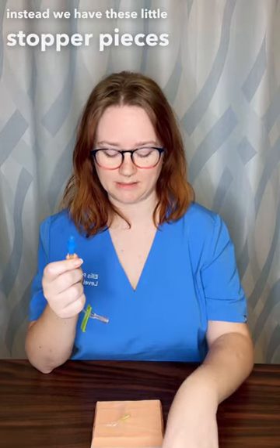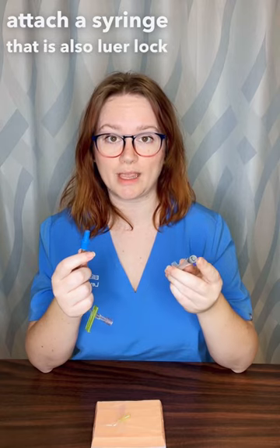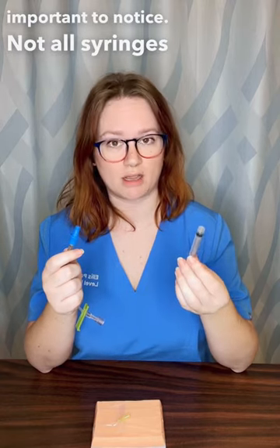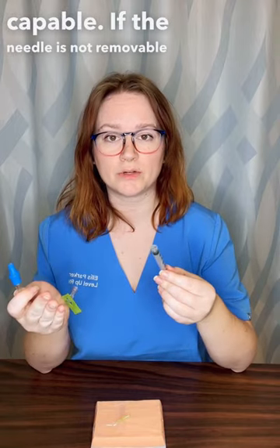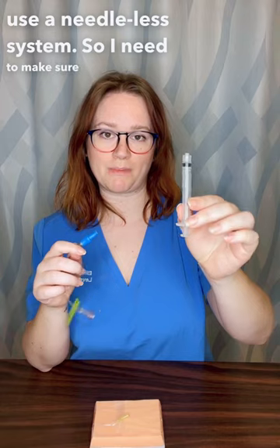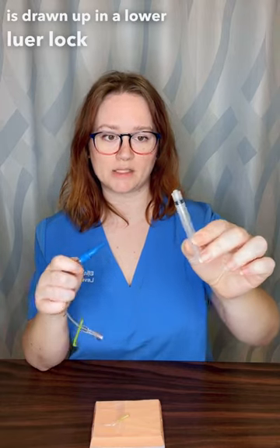Instead, we have these little stopper pieces that we can attach a syringe to that is also Luer-lock capable. Not all syringes are Luer-lock capable — if the needle is not removable, then I can't use a needleless system. So I need to make sure my medication is drawn up in a Luer-lock syringe.